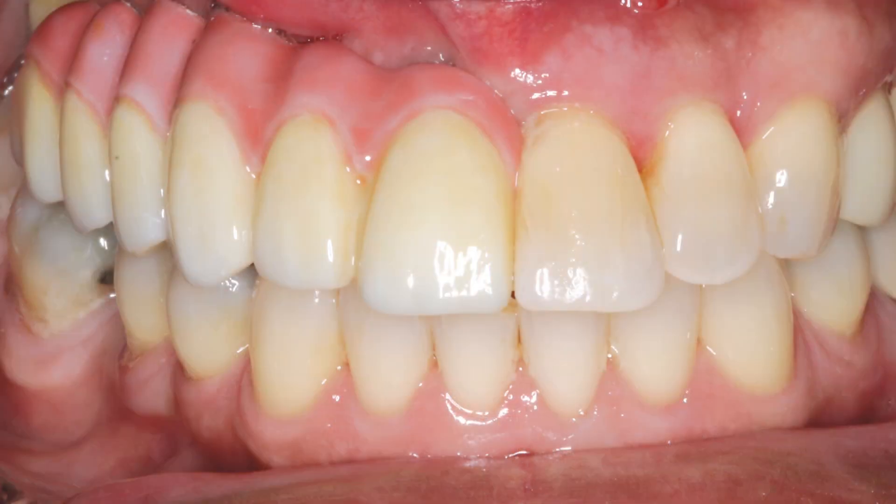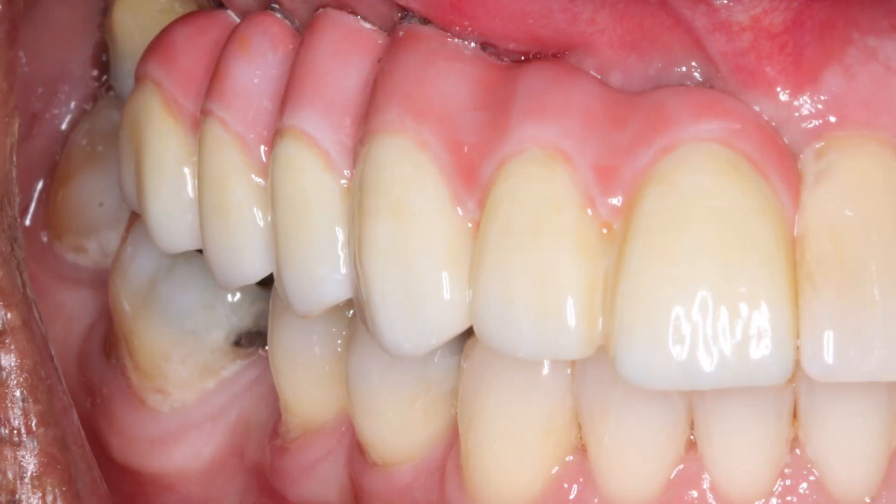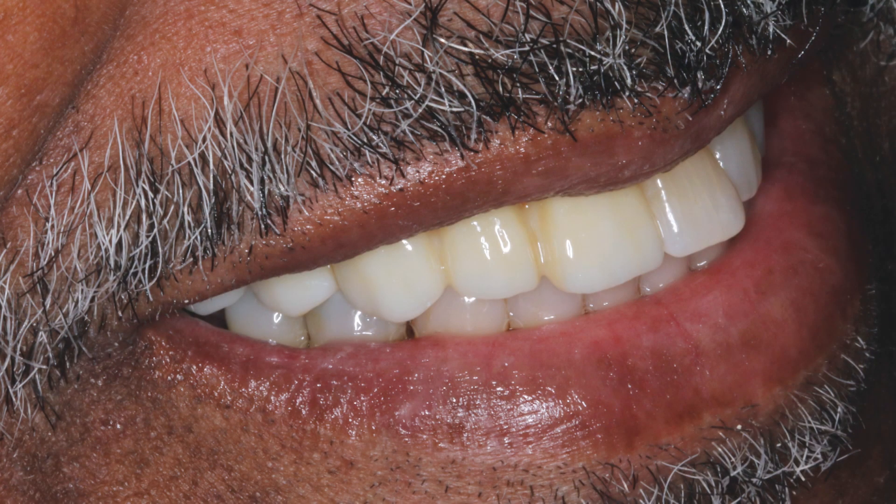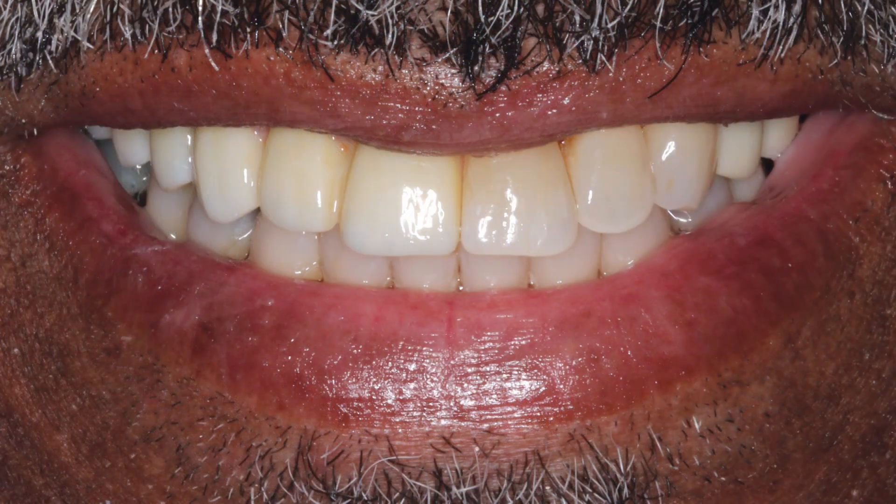We see the final Bruxer solid zirconia prosthesis seated in the mouth and evaluated for aesthetics and contours. The desired smile design was achieved and the patient was thrilled with the functional and aesthetic final result.